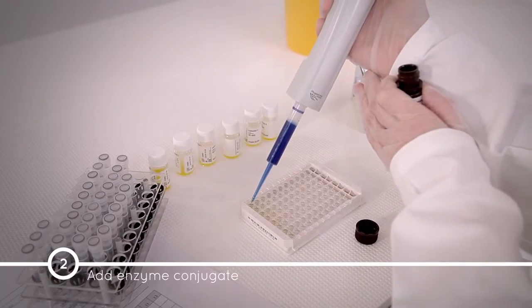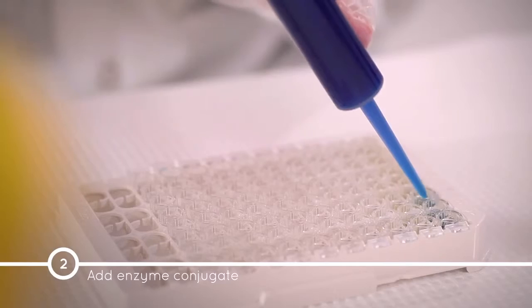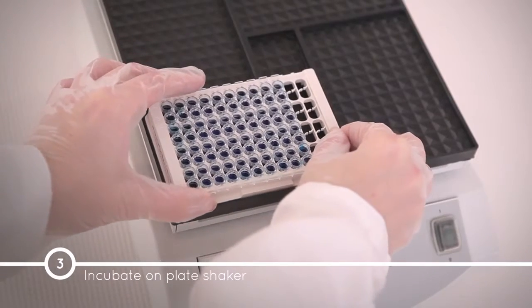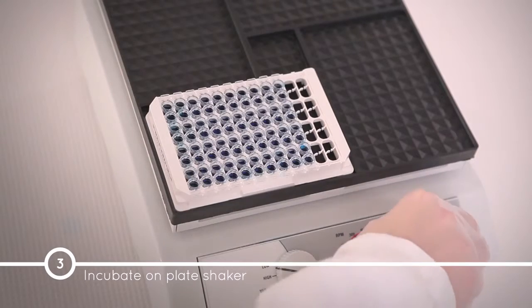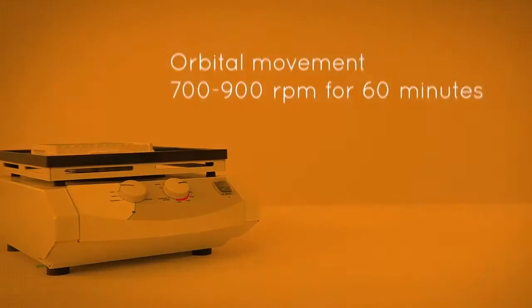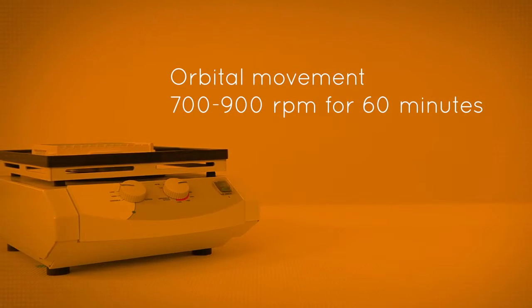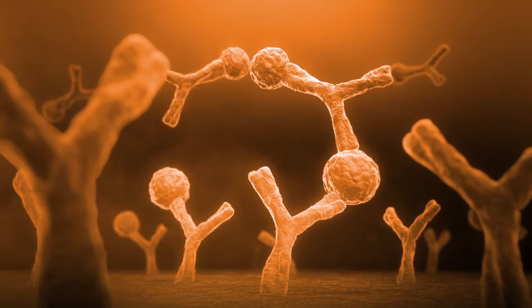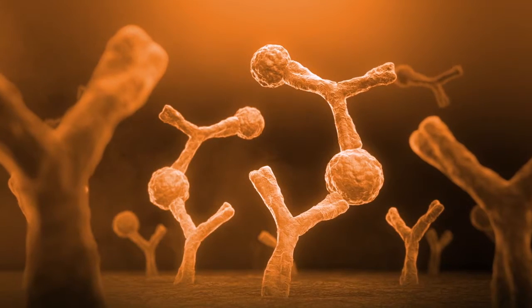Now add 100 microliters of enzyme conjugate 1X solution into each well and incubate on a plate shaker with orbital movement set to 700 to 900 RPMs for 60 minutes. The enzyme conjugate 1X solution contains the monoclonal detection antibody, which will bind to a second epitope on the antigen.